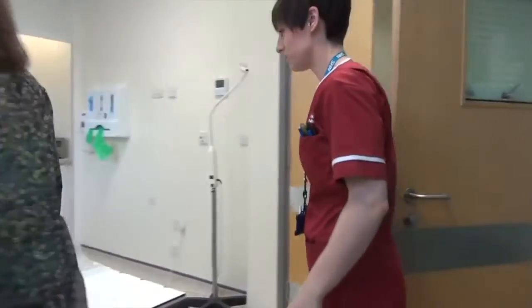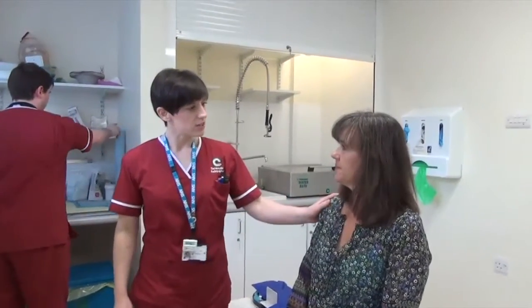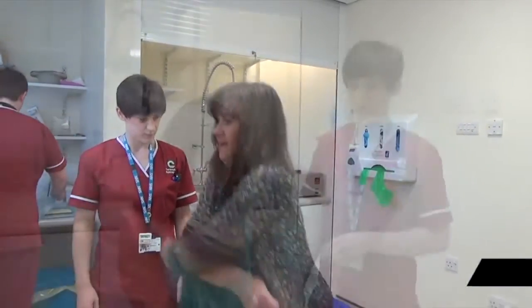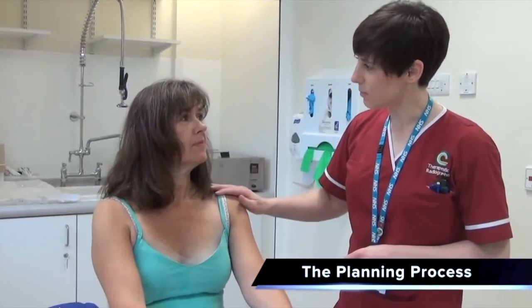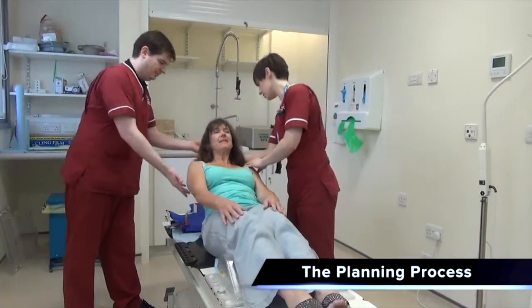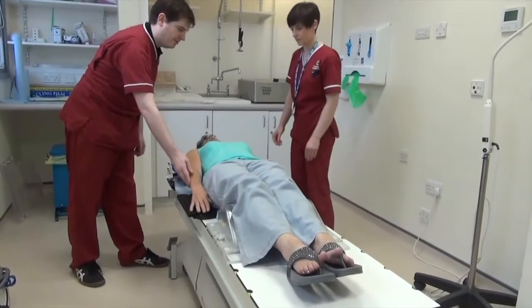For the purpose of this video we will demonstrate radiotherapy for the head and neck. The first step in the planning process involves immobilisation of the patient so that the radiotherapy treatment can be accurately targeted. This is done in the mould room where a support cast or mould is made.